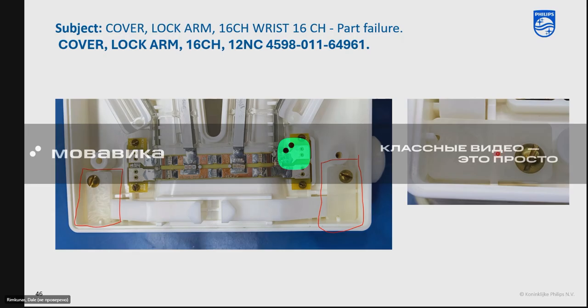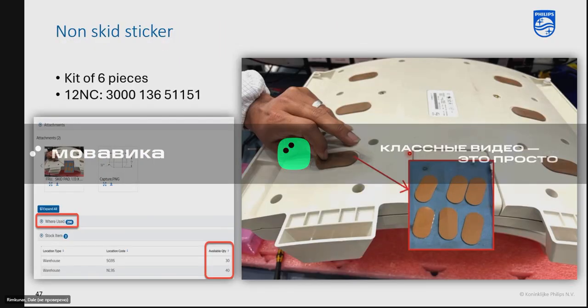It costs probably €2. I'm sure they charge us €50, but it is available. Here's the 12NC number for it, and that's available in center as well. Also, little things that never got addressed in the past are now being made available.